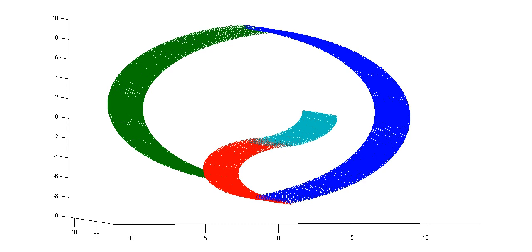So I do not know the details of this, but my understanding is that basically the strength of the magnet allows you in some way to get a higher resolution image. So voxels can be different sizes depending on both the strength of the magnet and the amount of time you're willing to average over to get that voxel. So there's a bit of a trade-off between how much time you spend, how many voxels you could collect, and the resolution.